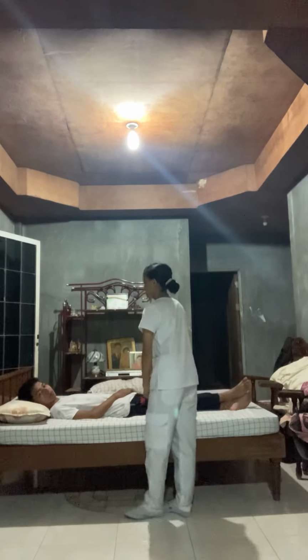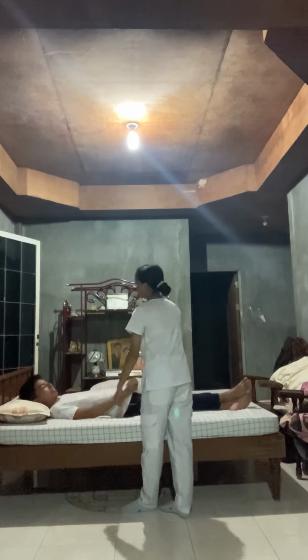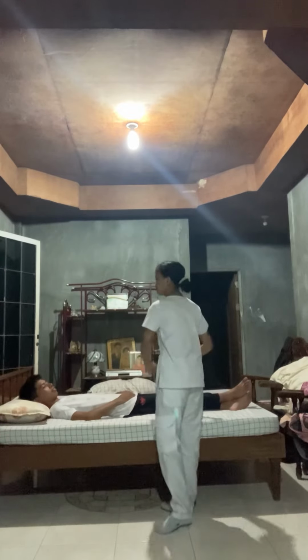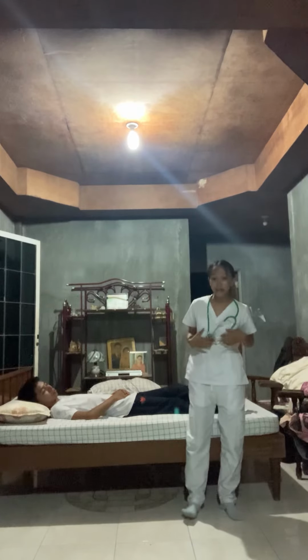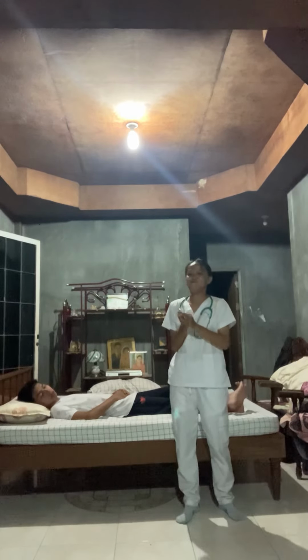So, sir, please lift your shirt. Let us assume that we are going to lift the shirt. So, next is auscultation of the abdomen. So, procedure, warm the hands and the stethoscope diaphragm, then auscultate the abdomen. Rationale: cold hands and a cold stethoscope may cause the client to contract the abdominal muscles.